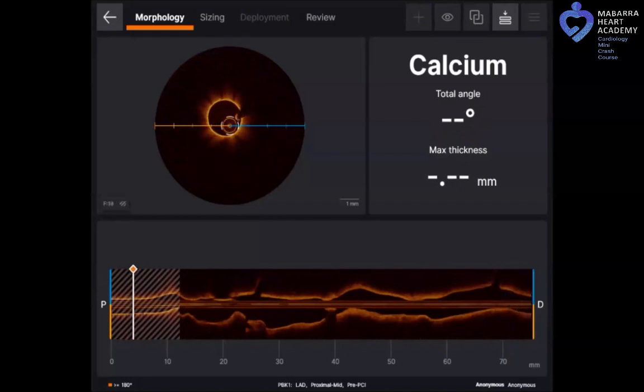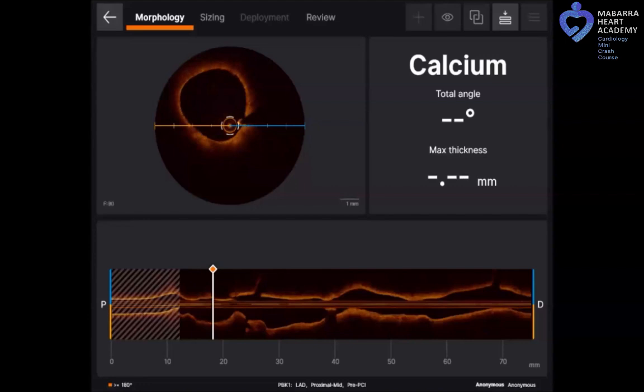As you can see in the proximal vessel, there's mild plaque, relatively normal, healthy tissue, and the critical stenosis in the mid-segment. And there was basically a tissue after the stenosis in the mid-segment.